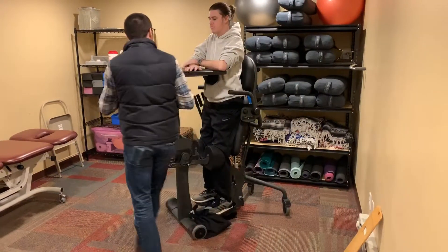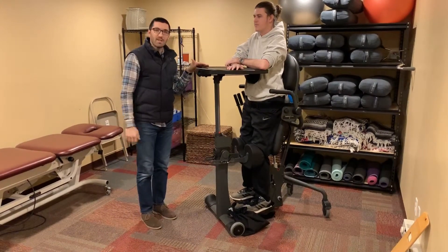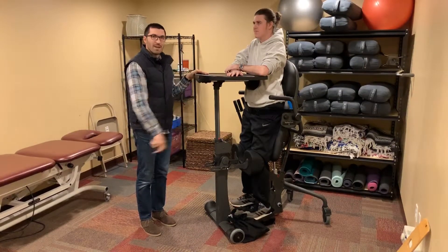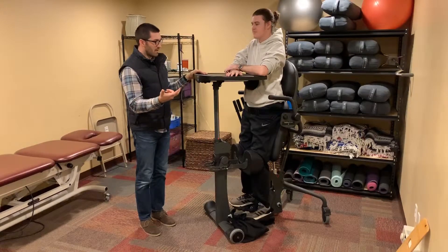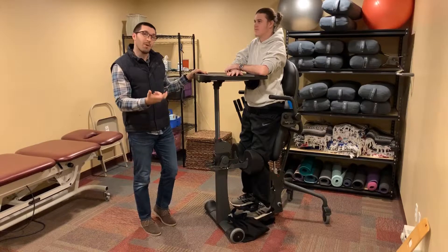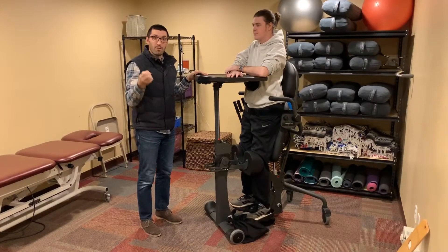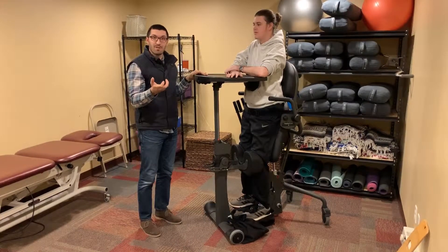In Trev's case, when he started doing this, we knew that we wanted to incorporate a standing program as part of his daily routine just to get some weight down through his lower extremities. There's some nice research out there that demonstrates loading those long bones in the legs is helpful with maintaining bone density, though it's not as good as putting force through those bones using the muscles, like you would get when you're using electrical stimulation.